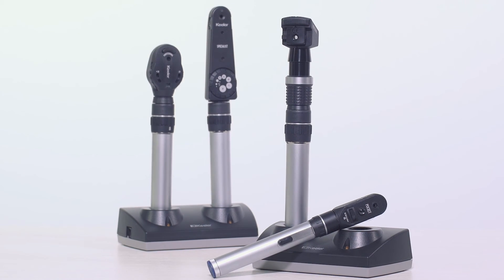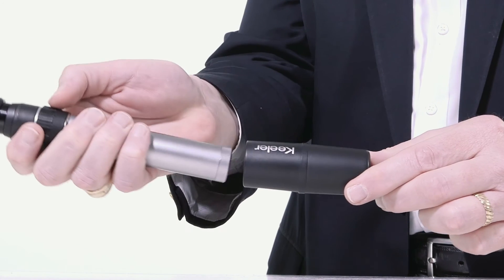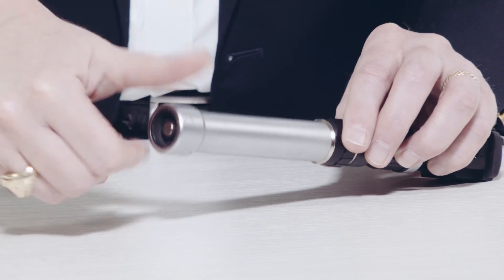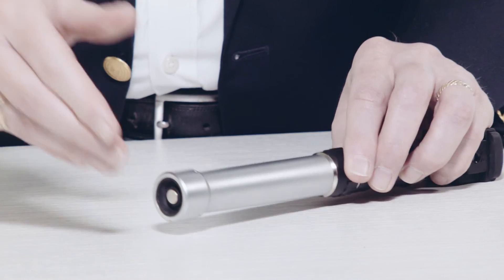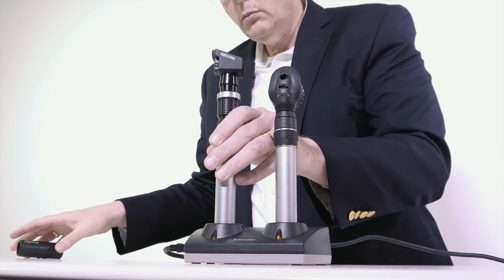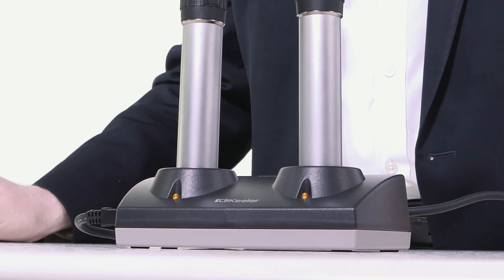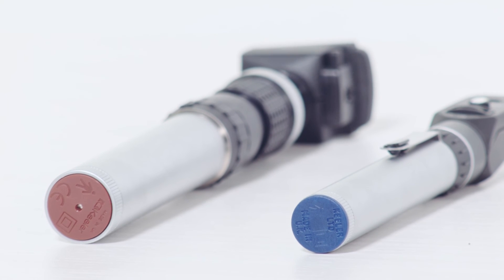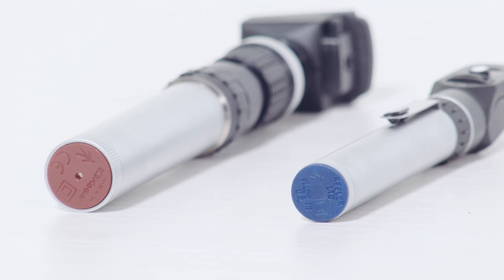Keillor rechargeable handles can be used with mini chargers, duo chargers, and most refraction stands. To charge an instrument using a refraction stand, simply attach the refraction stand adapter. Charge indicators show when a battery is low, charging, or fully charged. Keillor rechargeable handles have a red base, and dry cell battery handles have a blue base.